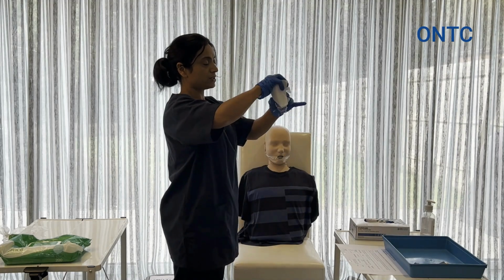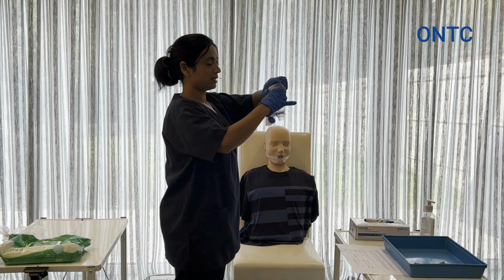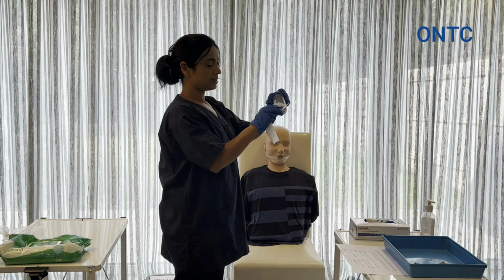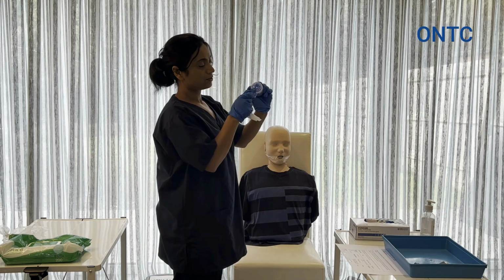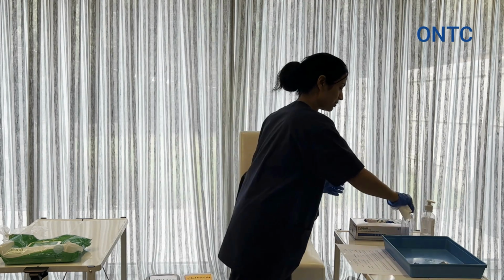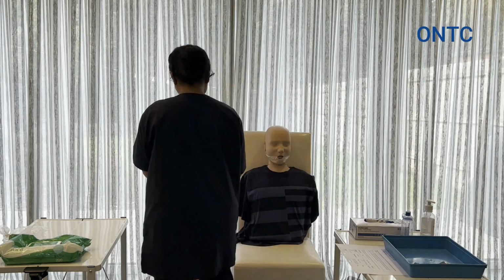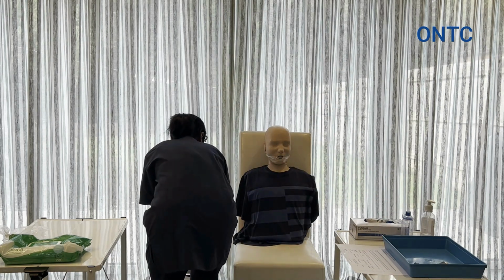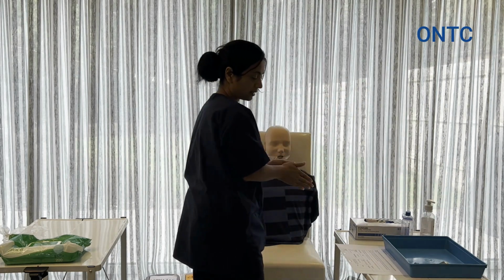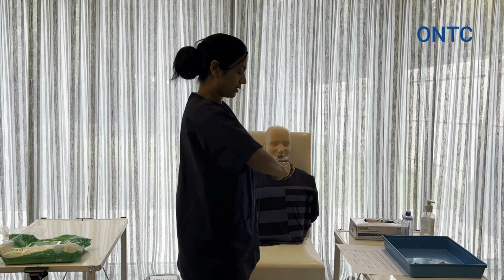So top towards the mouthpiece in a circular motion. Okay, going to clean this as well. Going to put that back on. We'll just leave it here for drying for you to take home. And I'm just going to get rid of this into the clinical waste, get rid of my gloves in the clinical waste, clean my hands and I'm going to document for the given drug.